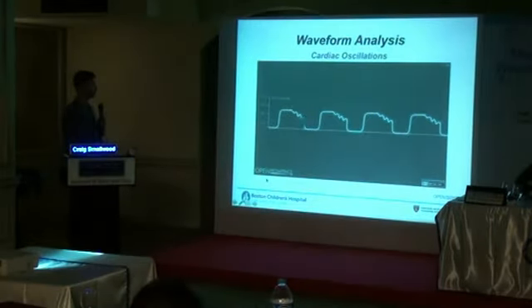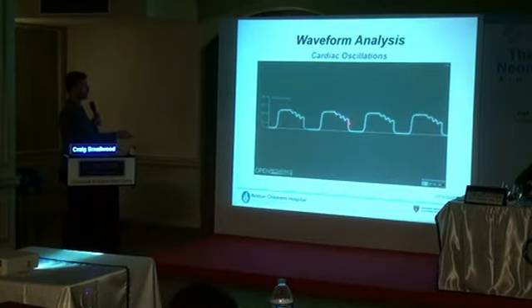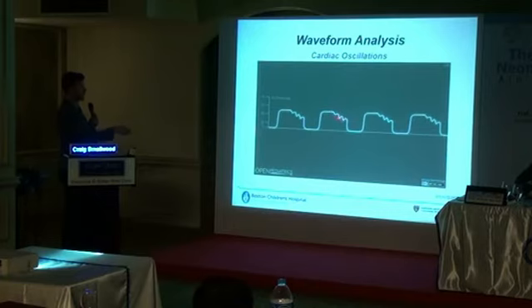So we're looking at cardiac oscillations, and you can see the animation basically is stepping through inspiration, transition zone, plateau, and then at the tail end of the alveolar gas phase of the capnograph, we see this periodicity, kind of up and down, and it's also decaying. So the partial pressure of CO2 is getting less and less as time goes on. And you can sometimes see that this goes all the way down almost to zero before the next breath starts.